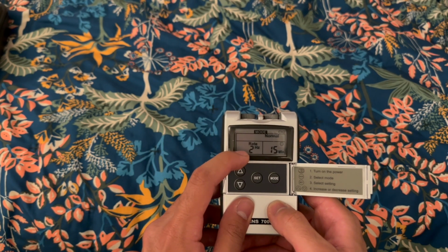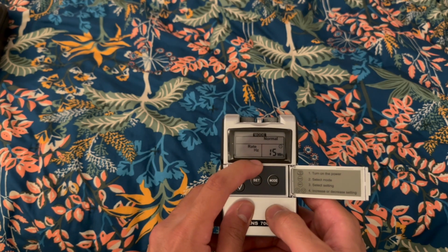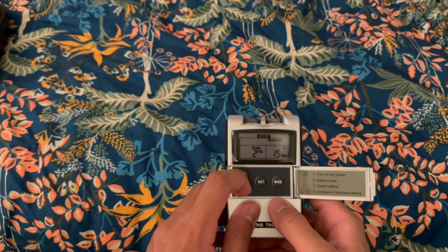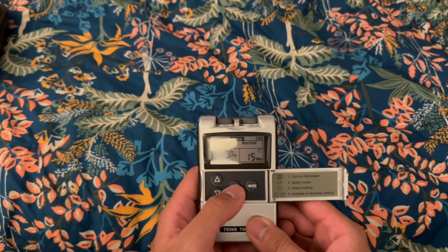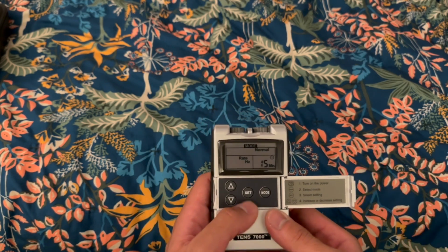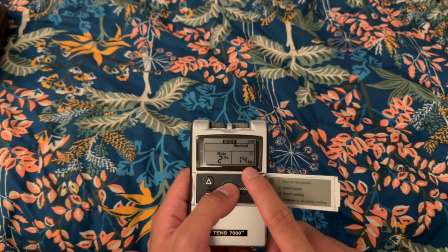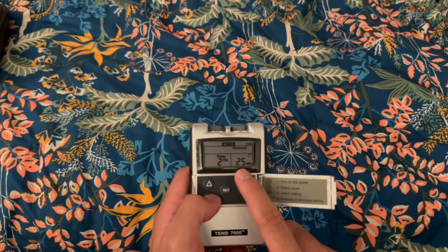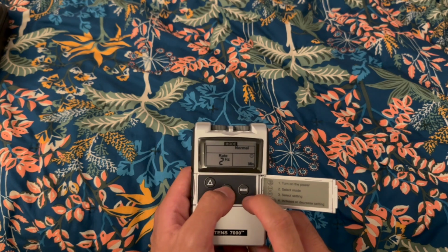We'll go ahead and set our rate between 2 to 5 hertz, and this will send a frequency of 5 hertz or 2 hertz through the wires once it's connected. So we can send brief taps towards the skin. You'll see it occur when we do our acupuncture treatment. For timing, let's press set one more time to get to the timing. Our time parameter would be between 20 to 45 minutes for treatment time when it comes to acupuncture TENS.